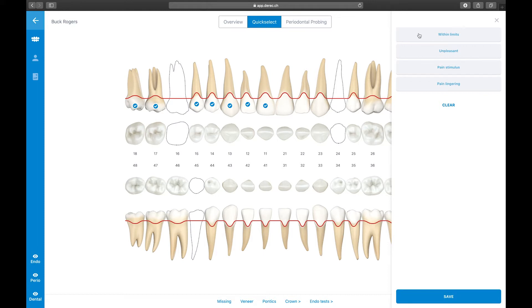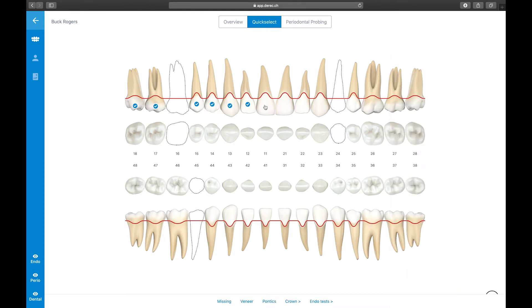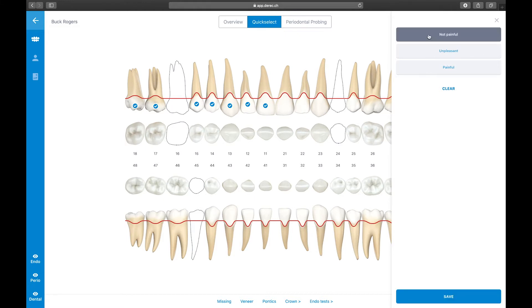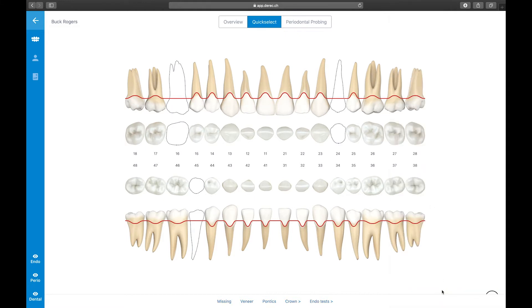Derek gives you the option to record not only the sensibility — for example, a positive or negative test result — but also the patient's reaction in terms of pain triggering. Repeat all actions for entering the Percussion test results. The Quick Select function is also used for entering larger prosthetic restorations like crowns, bridges, or implants. The degree of freedom it offers is outstanding, and there is literally no limit.